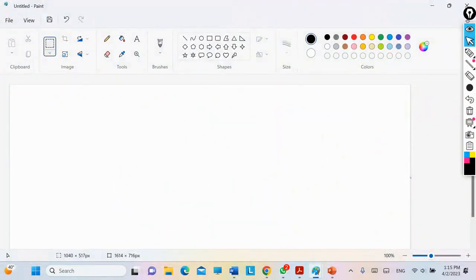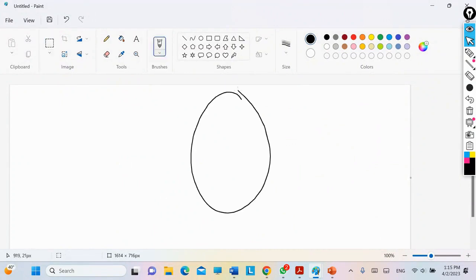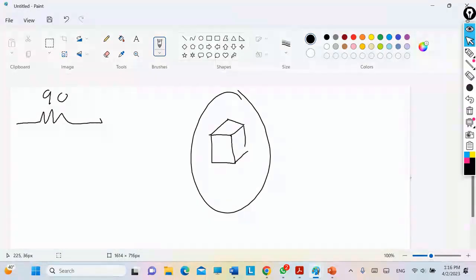Now let's focus together, everyone. Here is the brain, and here is the voxel that I want to work on. If my voxel has dimensions x, y, and z, there are other voxels and pixels next to it that I don't want. Do you remember my sequence? I used to give a 90-degree pulse. And with the 90-degree pulse, the slice selection gradient had a specific function. What was the function of the slice selection gradient?